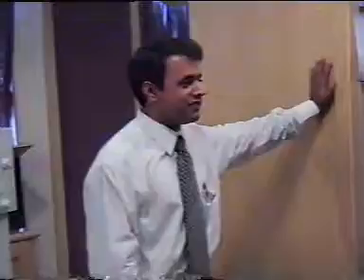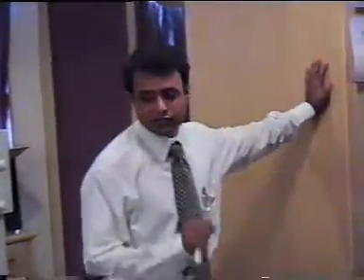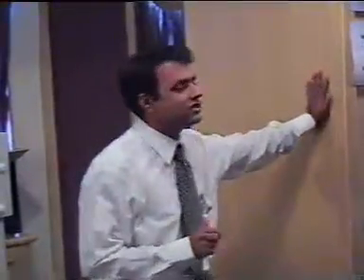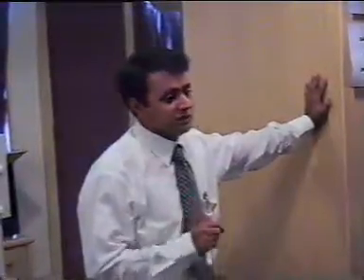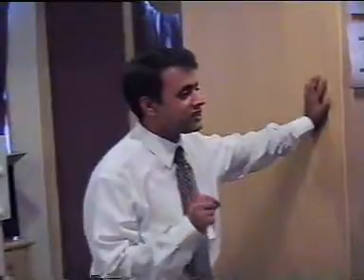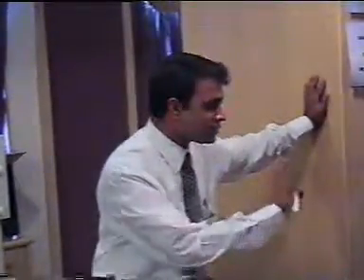Coming to what investigations will you do at this point of time? You can't get away with certain investigations. You can't get away with compromises in neonatology. That is one gold standard thing which you have to do. A chest X-ray is not required for ventilation. For ventilation, there is no investigation which is required.